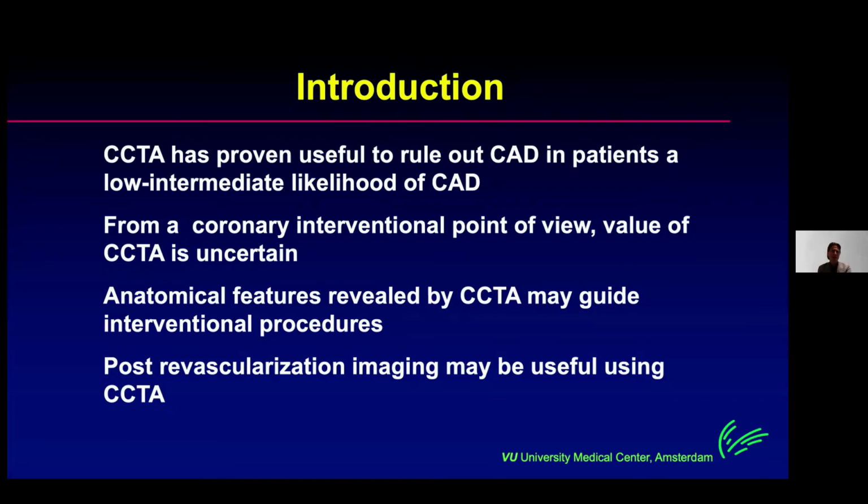The anatomical features revealed by CT may help guide intervention. As an interventional cardiologist, I'm very interested, obviously not as much in the rule out, but in the rule in. And we now have a lot of patients who have had revascularization, where CT may still be of interest. This is uncharted territory, which I think we need to explore.